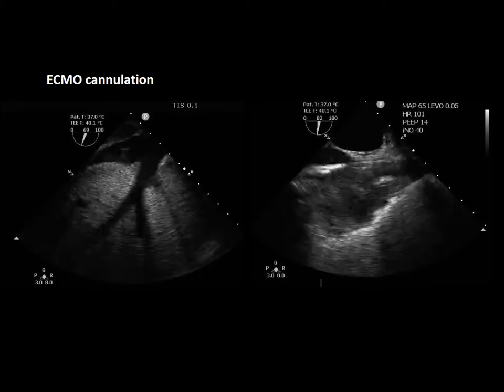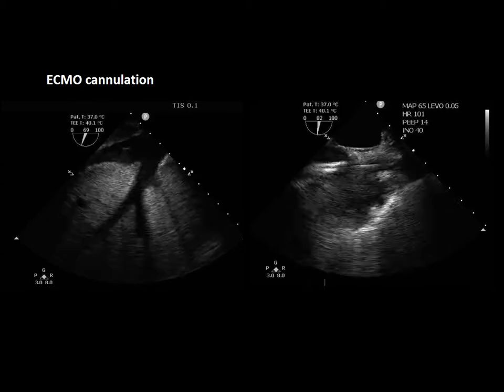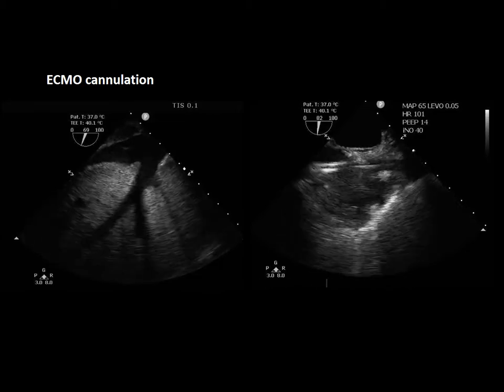In my opinion, this is the safest position for these wires to be, because even if the operator inadvertently advances the cannula too far, you are still in a vein. But if the wire has gone into the right atrium or in the right ventricle and the operator advances the cannula too far, then there's a risk of cardiac perforation.